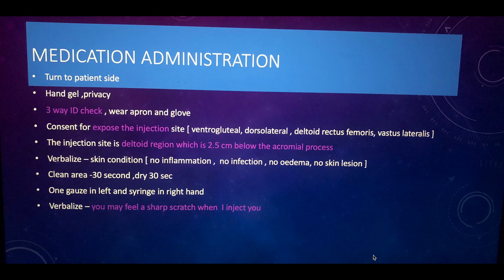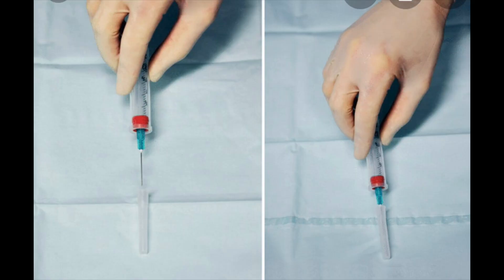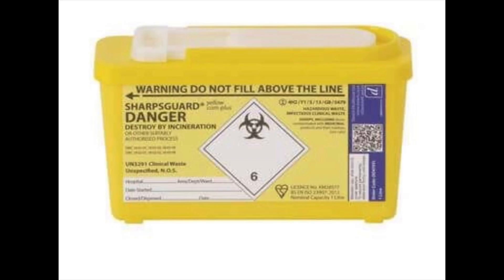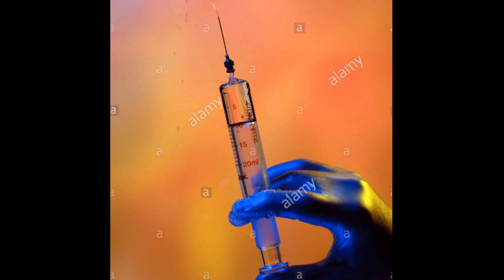Next, peel both the administration needle and the loading needle, and also the syringe. Keep them in the tray but never touch the key parts of the needle or syringe — perform this under ANTT procedure. Take the loading needle, connect it to the syringe, then slowly aspirate the medication from the vial or ampoule. For a vial, insert as much air as the volume of medication you want to withdraw before aspirating.